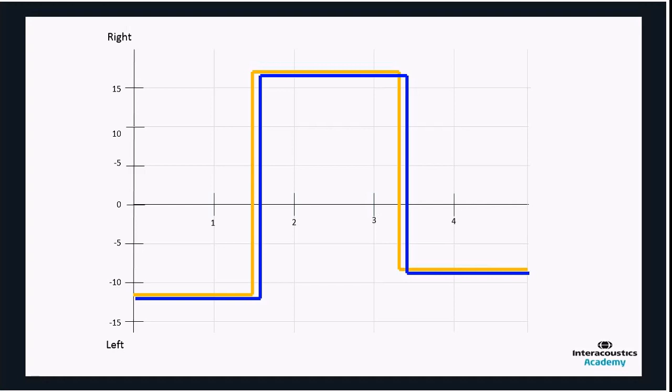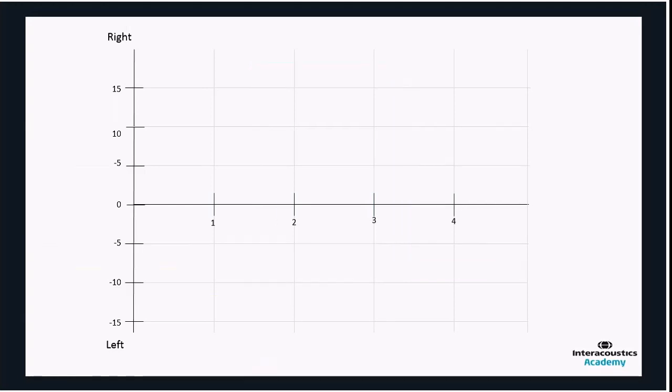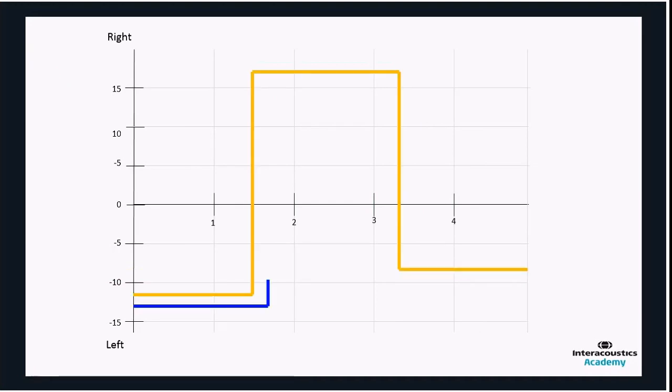What we can see here is a step change where the eyes have moved from a left position across primary into the right position, and they track the target and follow the target back once again. Now within this test we've got some different parameters that we can look at that allow us to quantify some of the abnormalities. So I'd like you to have a little look at our first abnormality here.